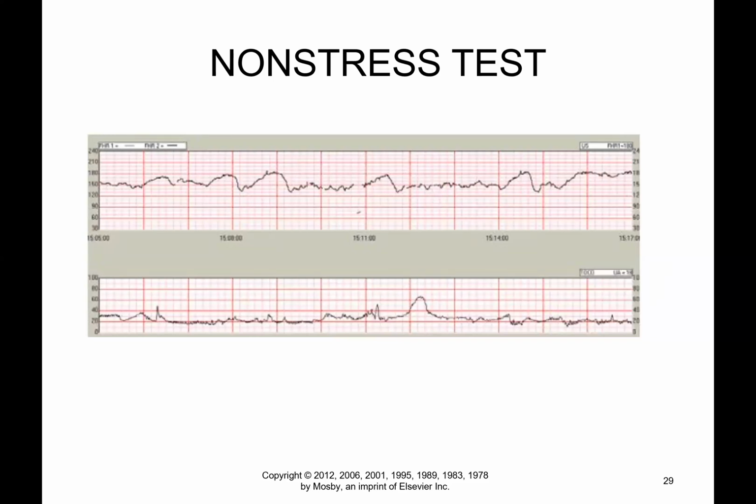So then the doctor will send them over to a biophysical to see if the baby passes that test. If the baby passes that test, they're good. They still feel good about it. The other thing that will happen, sometimes we fail a baby because the baby is not breathing or in too deep of sleep, then they will send them to the hospital to do a non-stress test. And if they pass that, then they're good. So they use both of these tests together to really predict the baby's well-being.